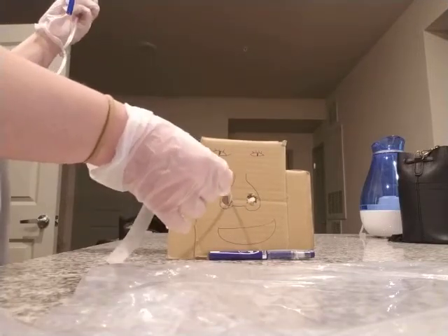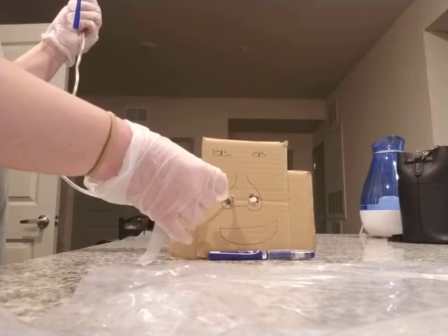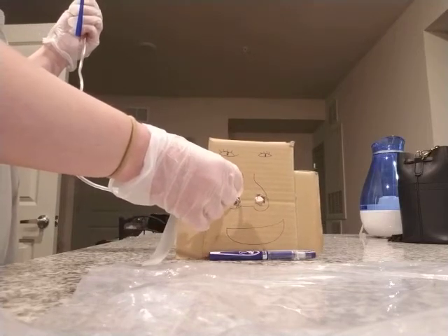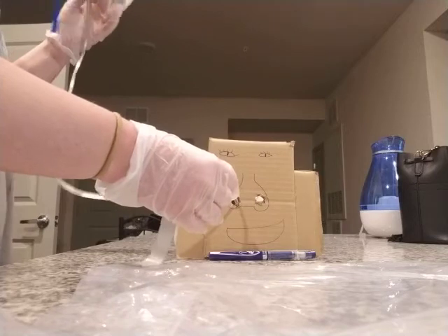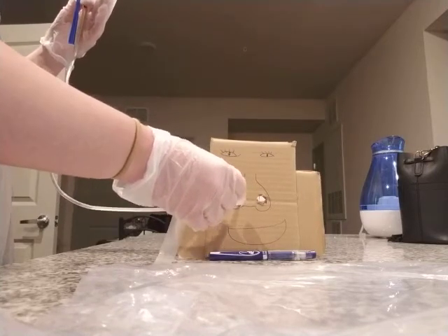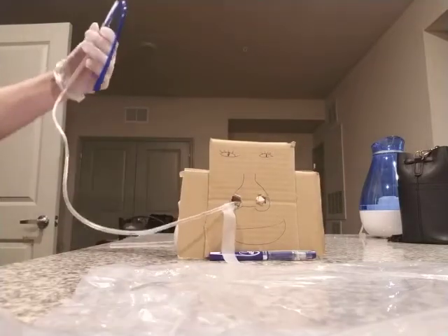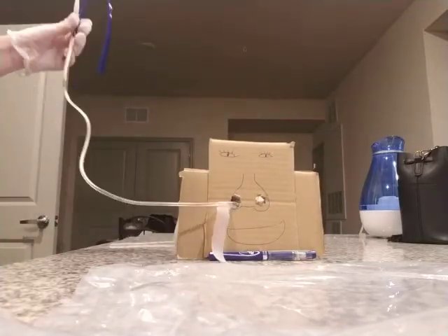And again, this is until I reach the tape. If any gagging or coughing occurs, I'm going to withdraw the tube a little, allow the client to rest, and continue again to advance. We're going to advance until the tape mark has been reached, which is right there.